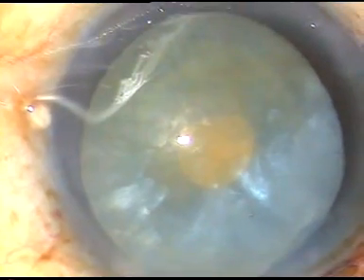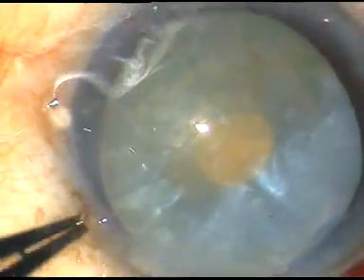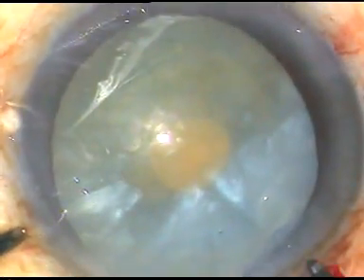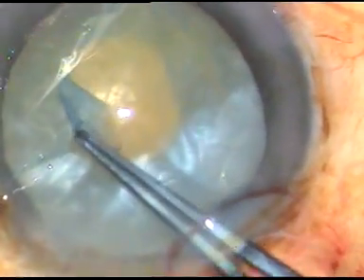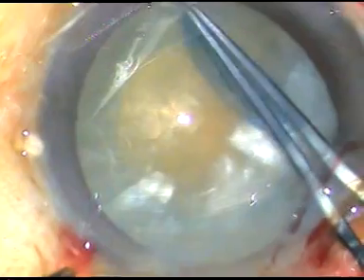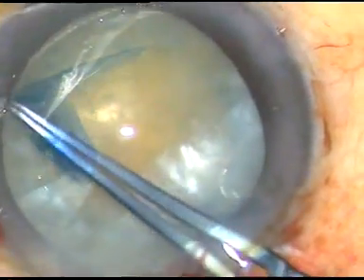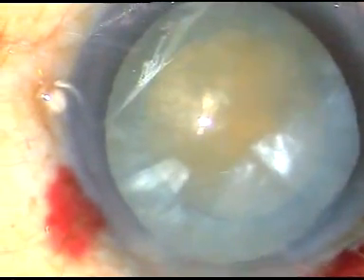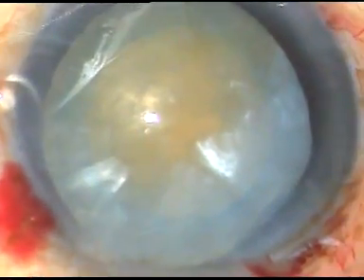Thus, in all cases, through the small rhexis, whenever I aspirate out some cortical lens matter, the intralenticular pressure drastically decreases and the intumescence goes off — the cataract becomes an ordinary one. Now a small cut is given at the margin of this small rhexis, the utrata forceps is taken again, and this small rhexis is enlarged into an optimum-sized one. See how beautifully it can be done. At the main incision, you tent the anterior lip so that leakage of viscoelastic substance becomes minimal.